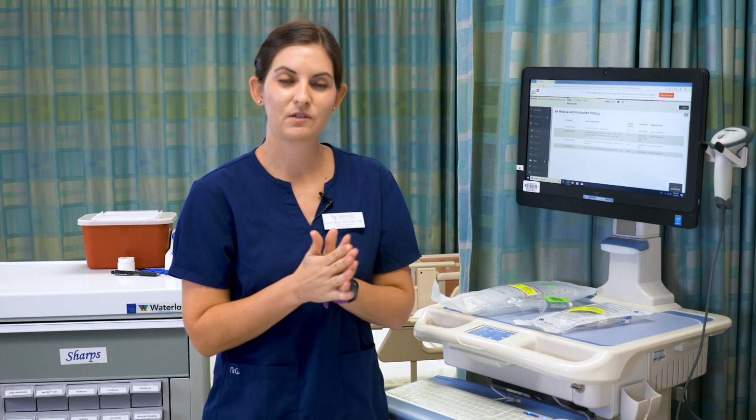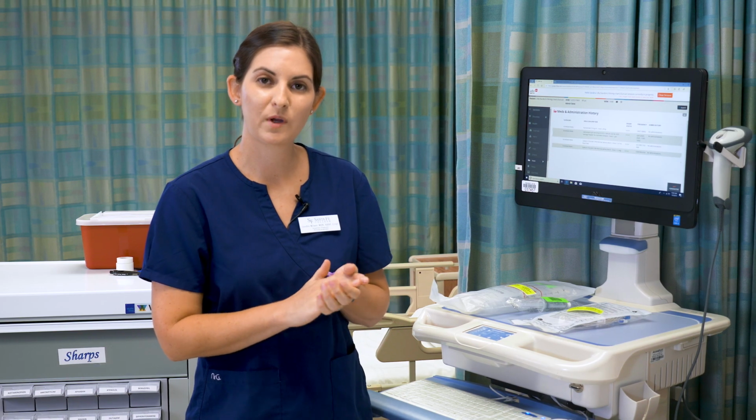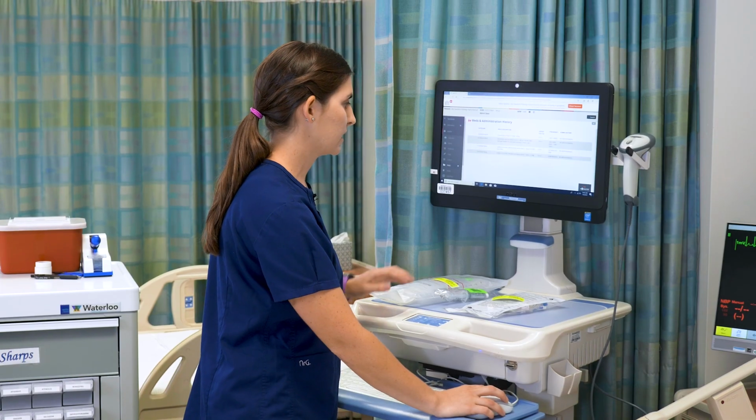Next, I'm going to administer my medication to the patient. First, you need to explain to the patient what medication you are administering. We're now going to scan the patient and scan our medication.